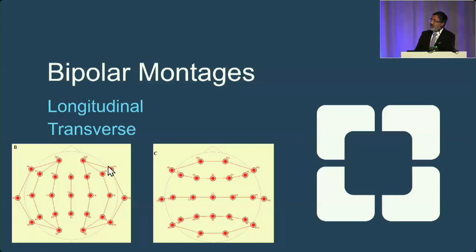In the longitudinal montage, the electrodes go front to back, giving you what is essentially a sagittal view of the brain, going from the side. It's beautiful to compare right and left hemispheres because there's nice symmetry here. The first chain of electrodes goes from the FP1 electrode to O1, so that's the left temporal chain. The next chain of electrodes is often FP2 to O2, the right temporal chain. So here we have homologous regions of the brain being compared, and you can look at that as a way to distinguish sides and how equal the activity is from homologous regions.